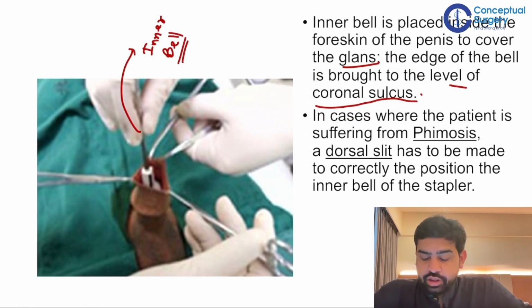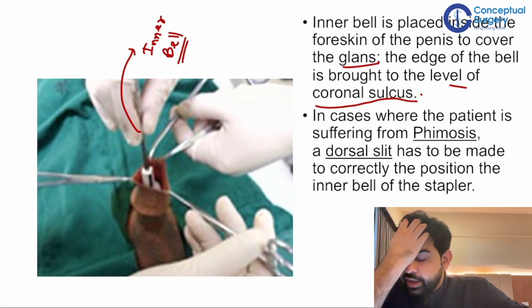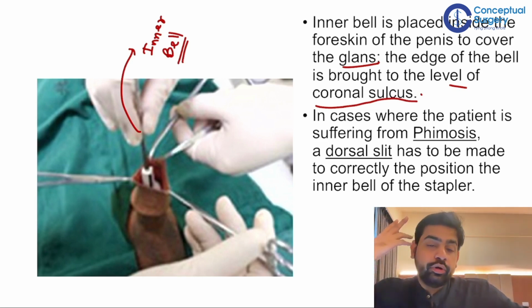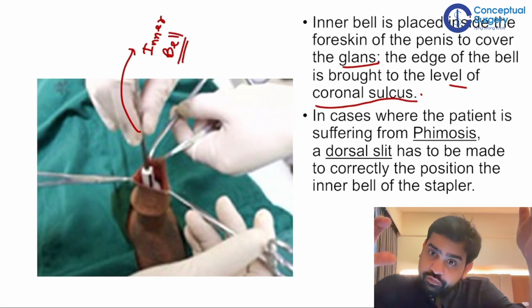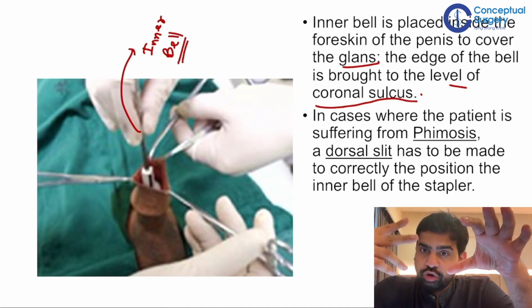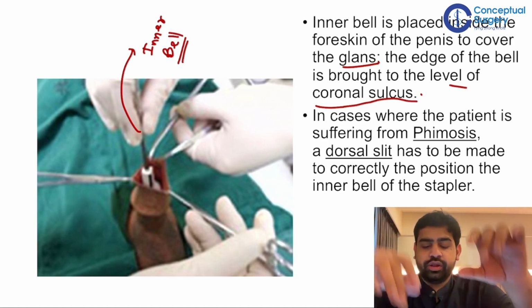In a case where the patient is suffering from phimosis, a dorsal slit has to be made correctly for the position of the inner bell and the stapler. Are you understanding my point? If the patients have a very dense phimosis, how will you place this inner bell? You will not be able to. So you have to perform a slight dorsal slit, because only then will you be able to place the inner bell. If the prepuce is slightly lax, you can place it very easily, no problem. But if it's a dense phimosis, then the dorsal slit might be needed in order to place the inner bell.